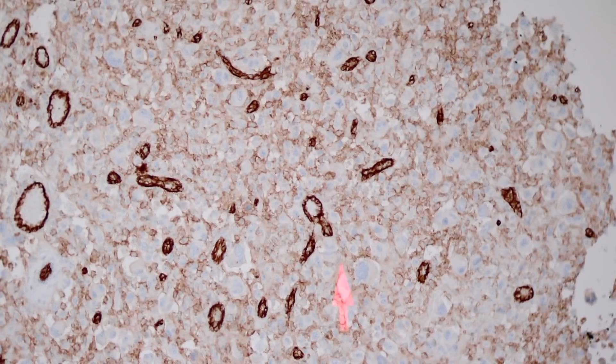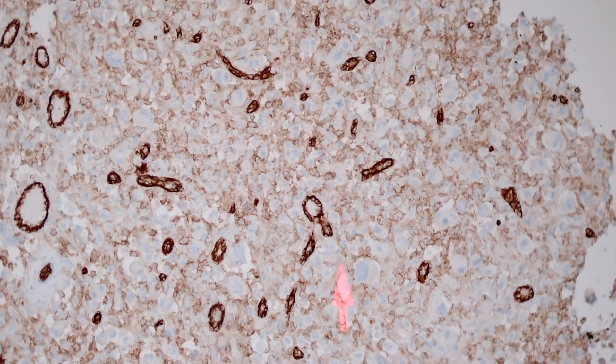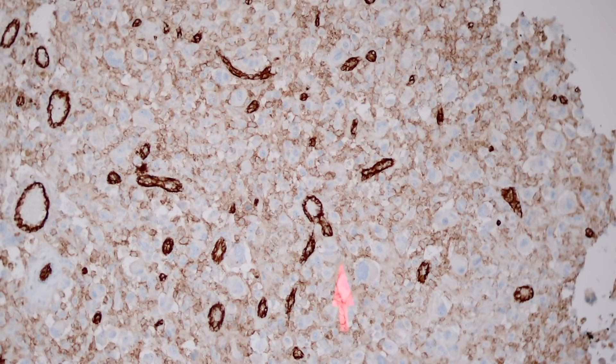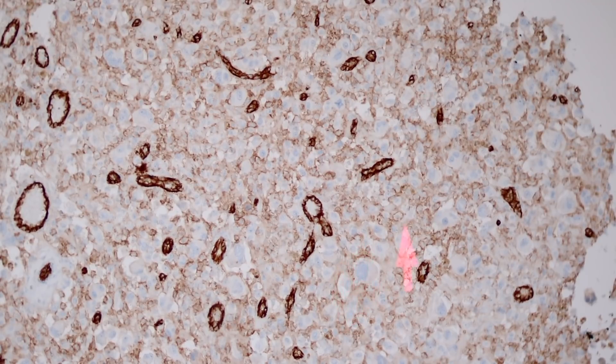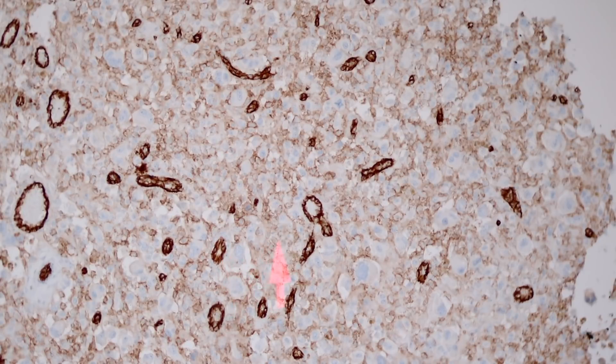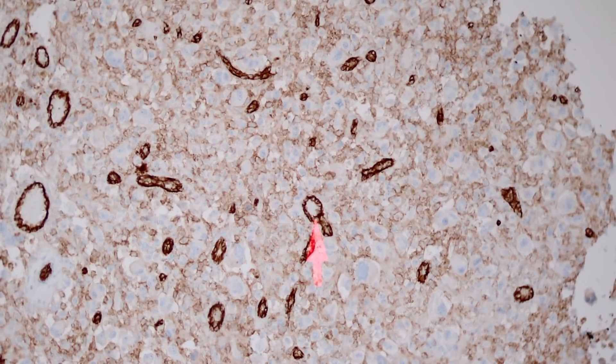The easy way to assess this, whether you're using CD31, ERG, or whatever vascular marker, is to look at the staining in your tumor cells and compare it to the intensity of the staining in the vessels.